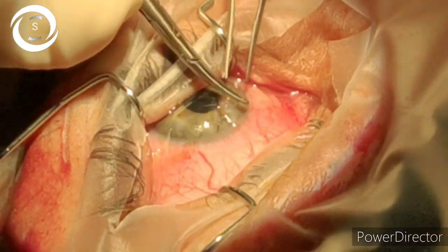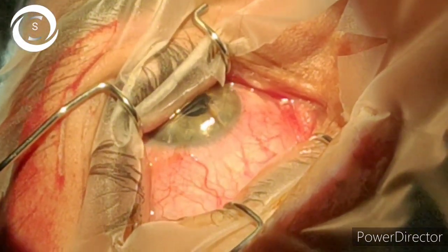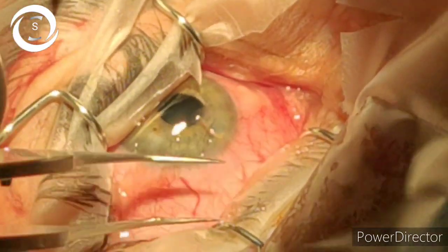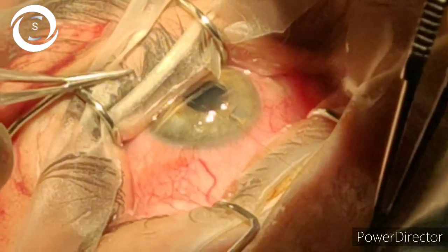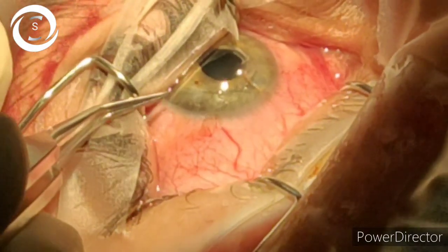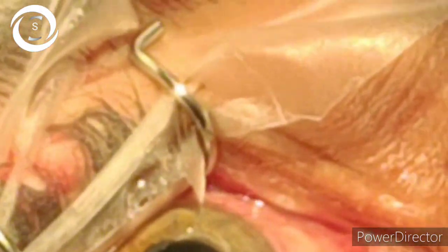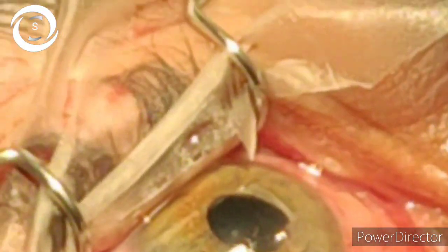Ideally a paracentesis port should be performed and the anterior chamber should be well formed with viscoelastic. Here, as the wound was clean and fresh, I put viscoelastic through the corneal wound to form the anterior chamber, which should not ideally be done. I started suturing with two horizontal sutures with 10-0 nylon. During the process the anterior chamber became shallow again.